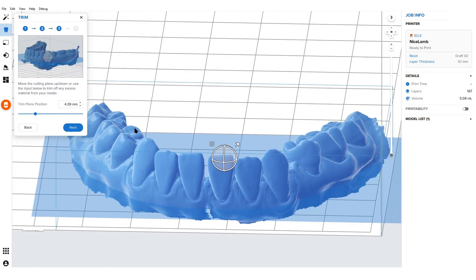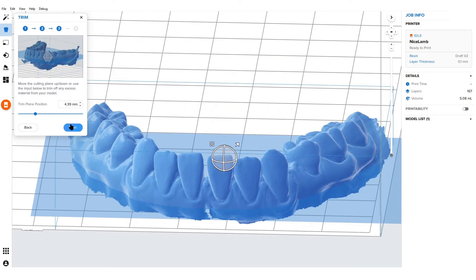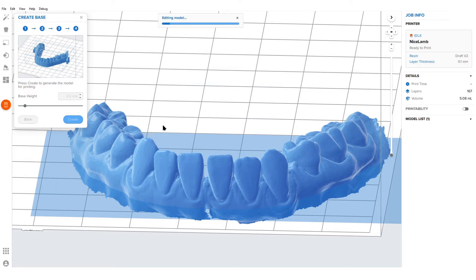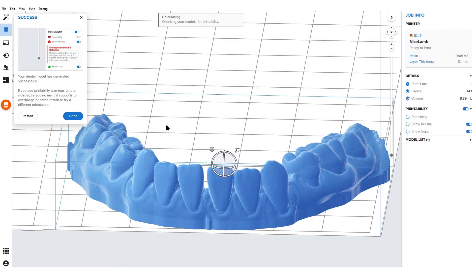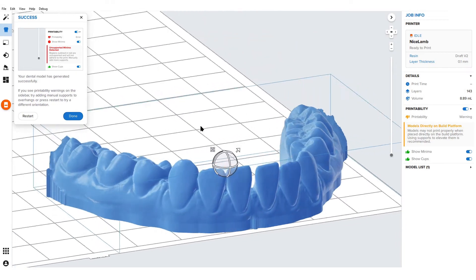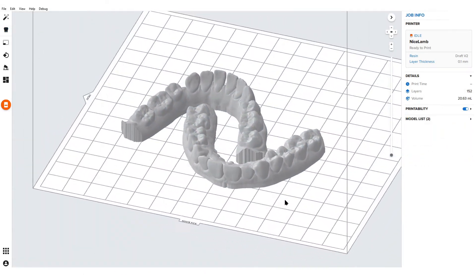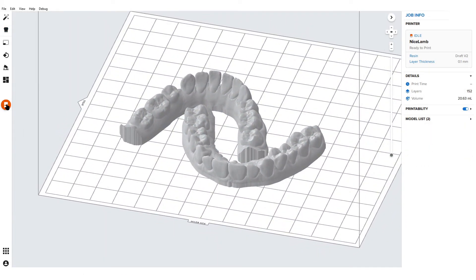Second, you can set a trimming plane position. This allows you to trim off extraneous data, and of course you can keep all the data if needed. And lastly, you can add a base height. You don't need to set a base height, but if you wanted to add additional height to the model, you can set a value here. Once that step's done, your model gets calculated and it's based appropriately.